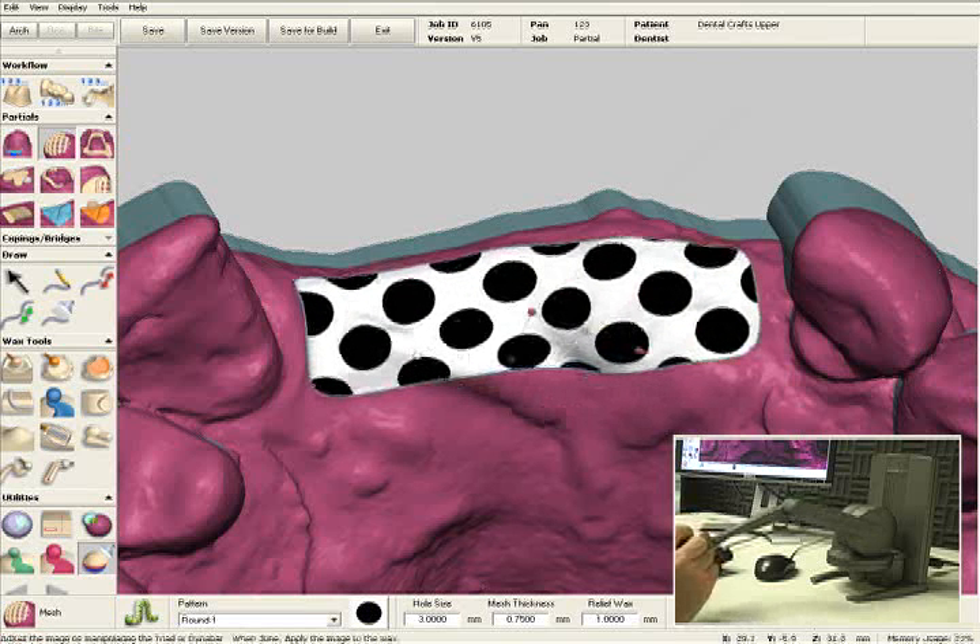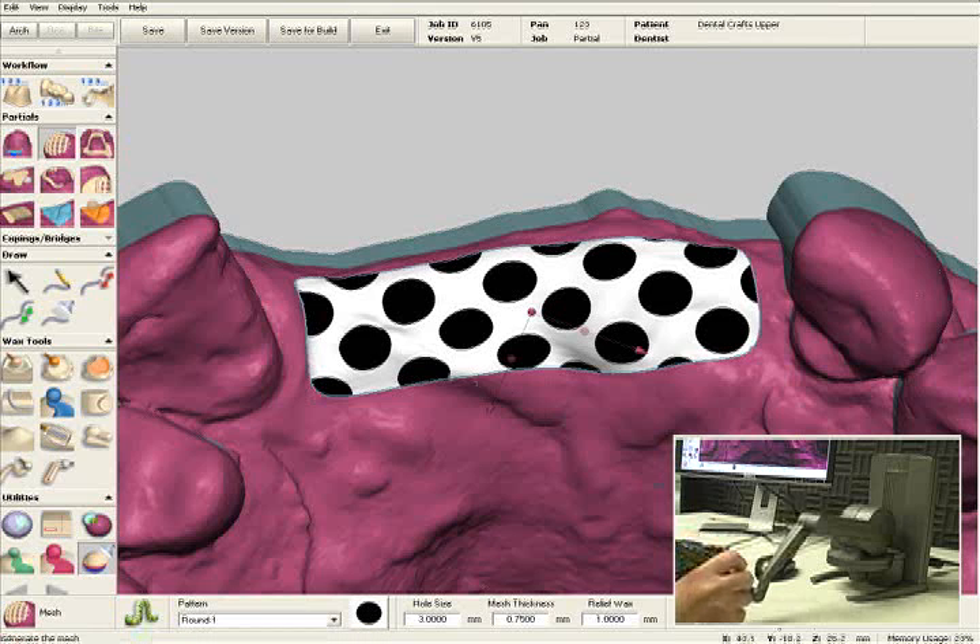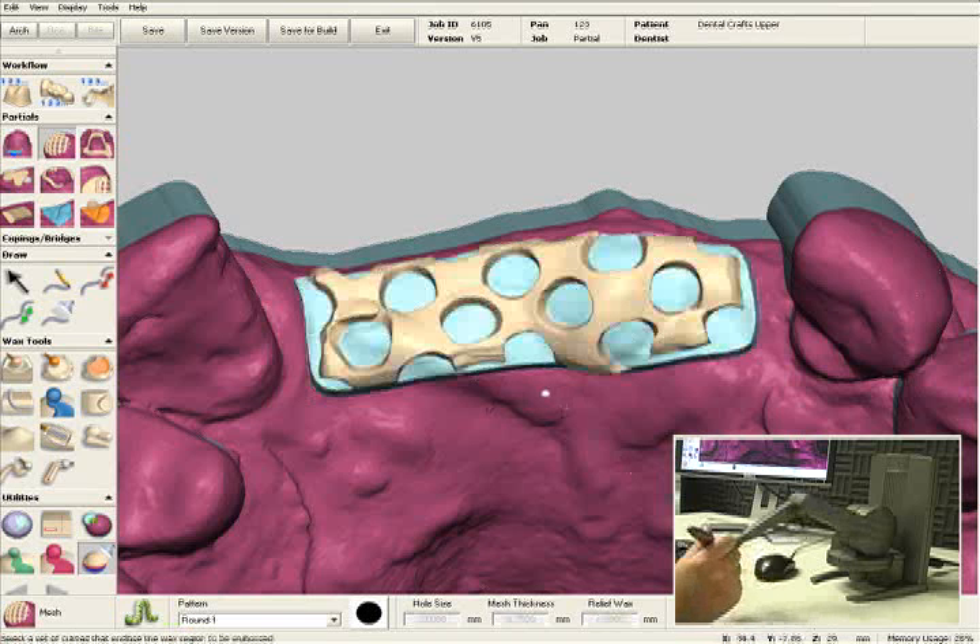Once you're happy with the position of the mesh, we will click on the apply button, which will create the digital mesh pattern and the relief wax at the same time. You can also preset preferences for your doctors and for your lab, which will deliver a level of precision and consistency that cannot be achieved with hand waxing.